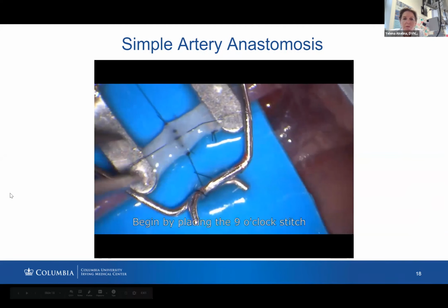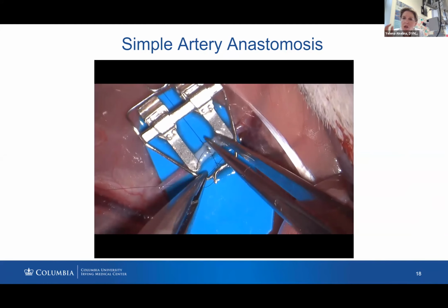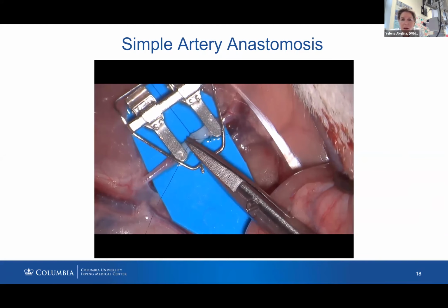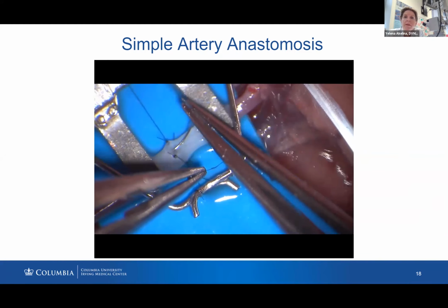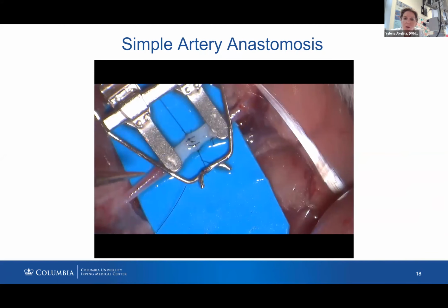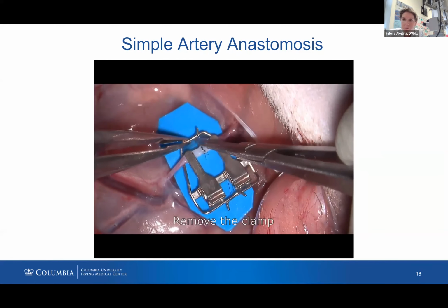So now we flipped it over, we finished the front, and now we're finishing the back. So now 9 o'clock. Checking the back wall stitches is very important. It's crucial actually. Sometimes I can leave the 9 o'clock on the back open to prevent catching the back wall also. So now you can see I'm lifting the wall to avoid the back wall. Small bites, 1 or 2 diameters of the needle from the edge, is very important.